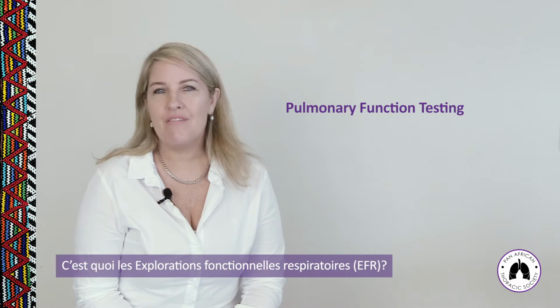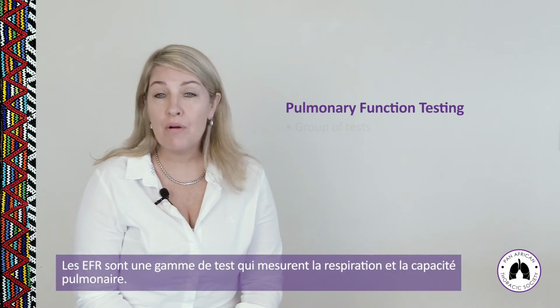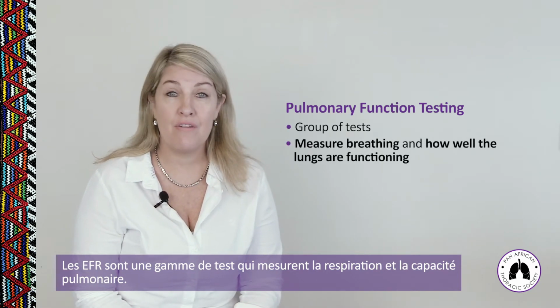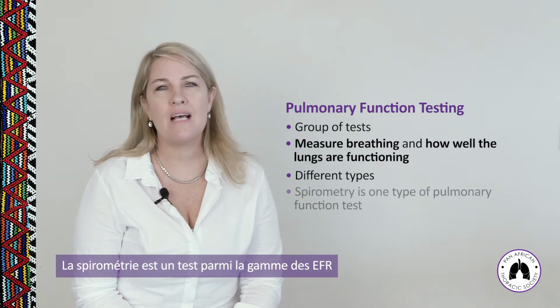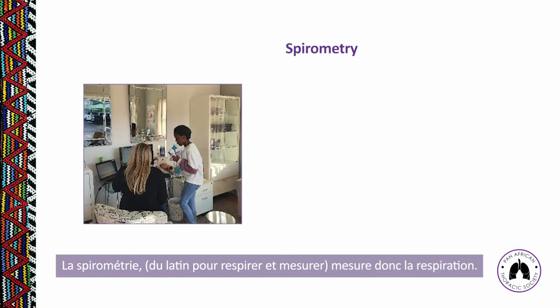So what is pulmonary function testing? Pulmonary function testing are a group of tests that measure breathing. They measure how well the lungs are functioning. There are different types of pulmonary function tests that can be done, and spirometry is one type of pulmonary function test. So what is spirometry?